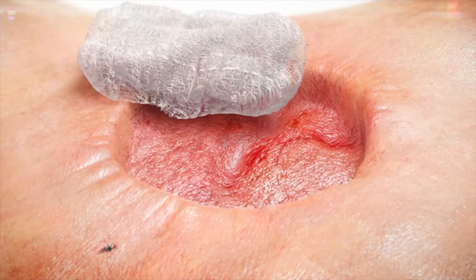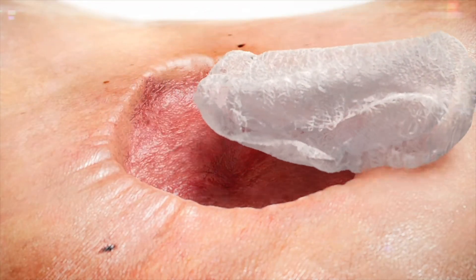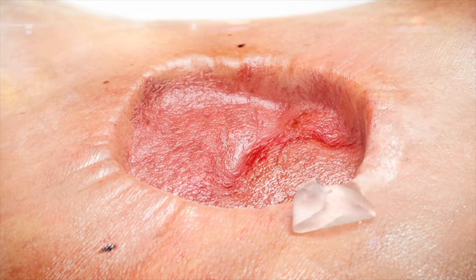Debride any devitalised or necrotic tissue, cleanse the wound bed and pat dry. If desired, protect the peri-wound skin from exposure to moisture and adhesive through the use of a skin sealant.